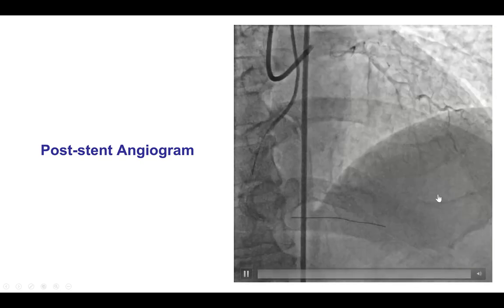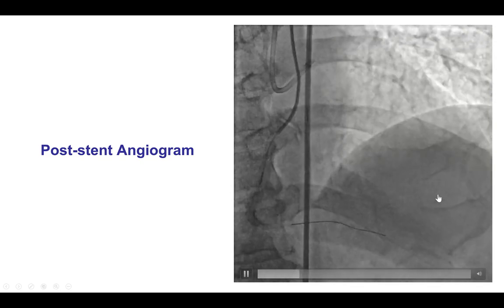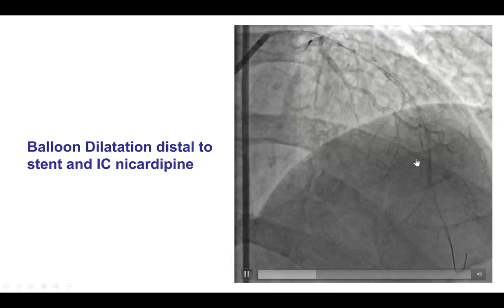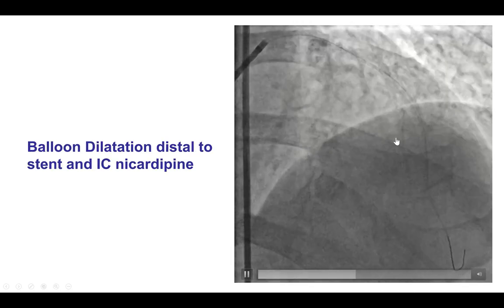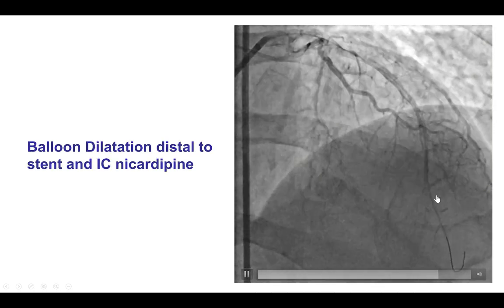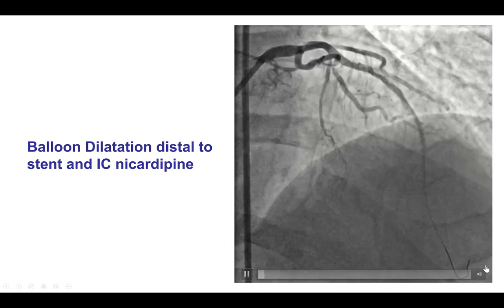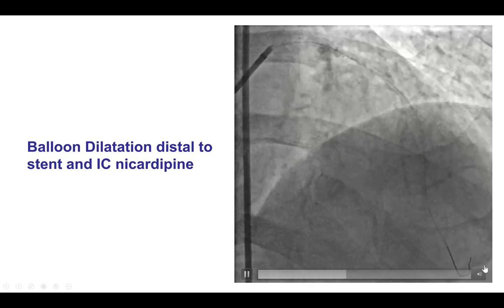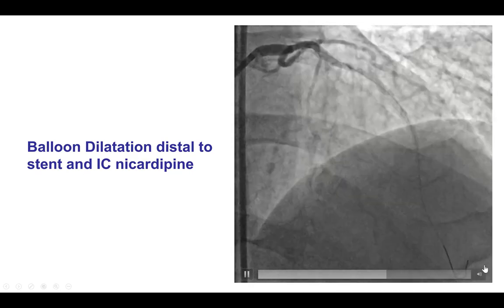There was still diffuse disease distally, and that is why intracoronary vasodilators were administered. An additional layer of stent was placed, with a nice final result and TIMI 3 flow to the LAD.